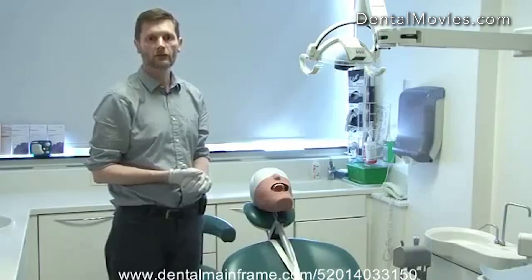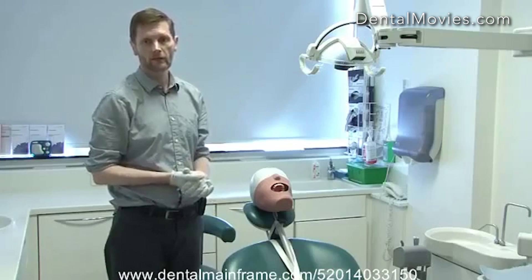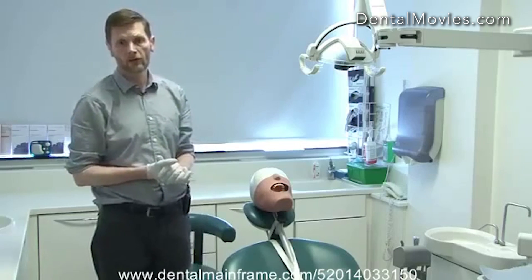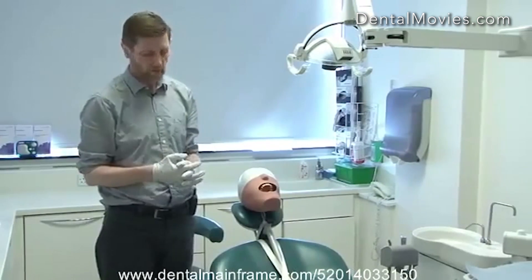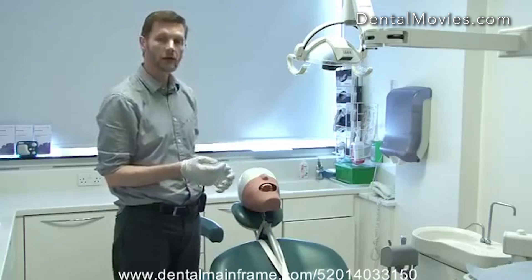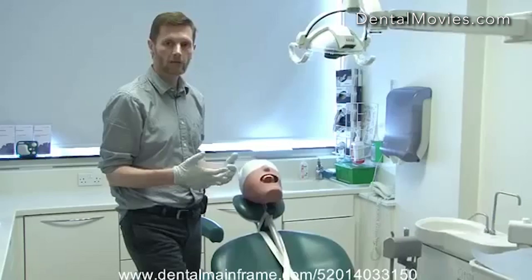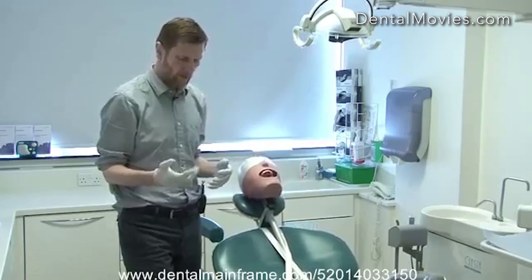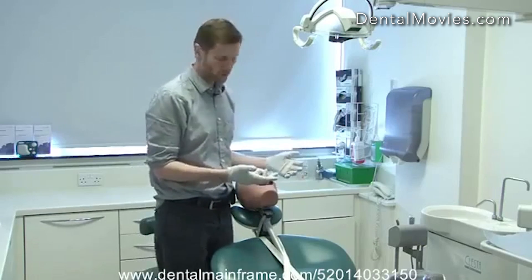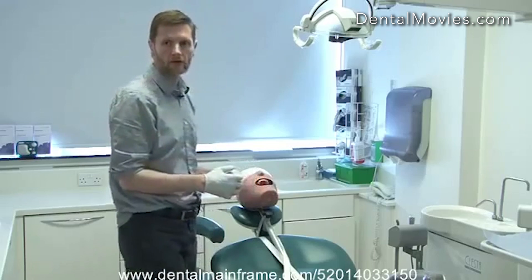Sometimes we're going to do treatment while standing and the patient is semi-reclined — most notably if we're taking teeth out or doing impressions for dentures. In these situations we're going to put more stress on our back, but the same principles still apply. You want to have the patient at a suitable height so that you can work with your elbows tucked in and forearms slightly raised, and avoid prolonged periods of leaning over the patient. For example, when doing an impression I could work comfortably either from behind or in front of the patient at the correct height.